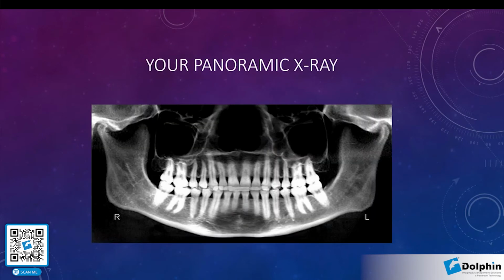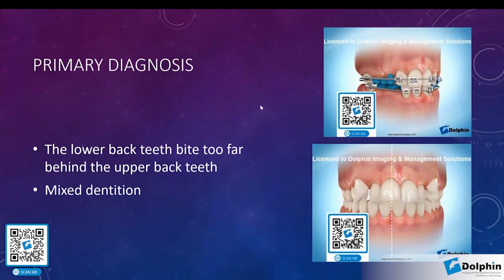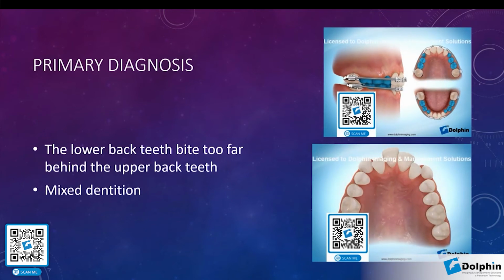You can customize all the transitions, the views, and so on in PowerPoint, of course. And now this is just some of the videos I've implemented in my PowerPoint. So you can see here I have some videos on crowding.